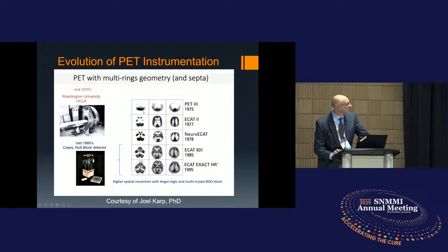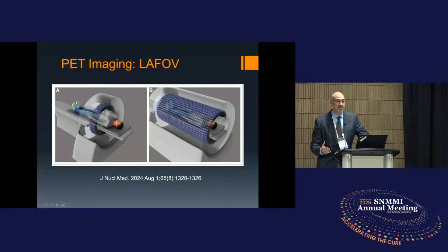One thing that has changed is you can see the quality of the actual pictures has gotten a lot better over time, because we have a whole section here on physics and instrumentation who work on how we make better scanners. Scanning technology tends to be very hard to calibrate and also is very sensitive and expensive.